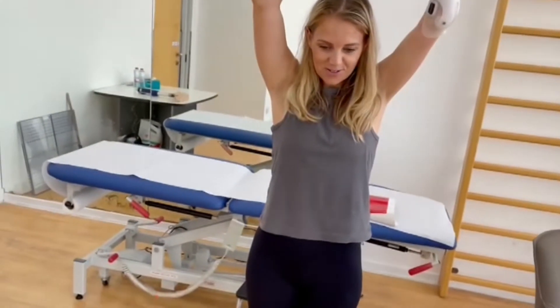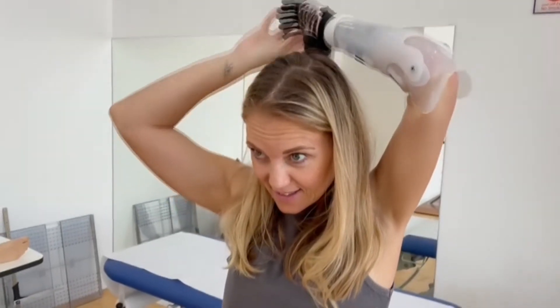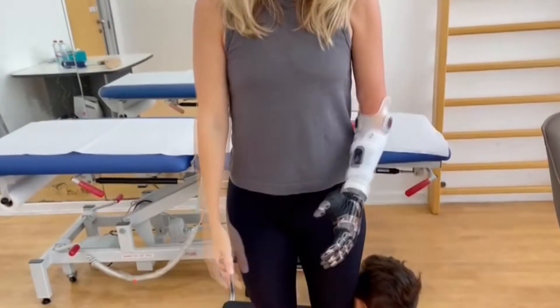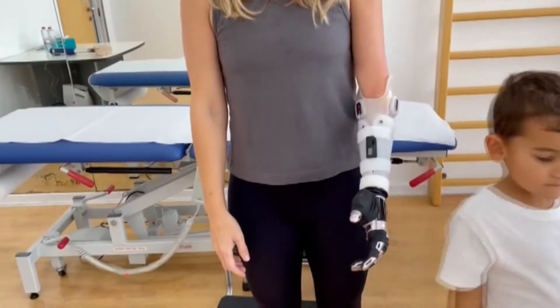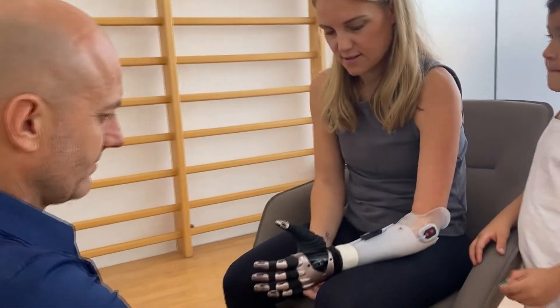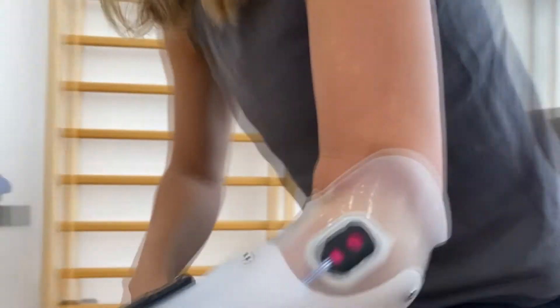Can you put it behind your neck? That's not going to come off — it feels like it might. Okay, straighten again. I'm going to practice, I'm going to get a bit stronger. Can you close it in this position? Obviously it's not really secure.